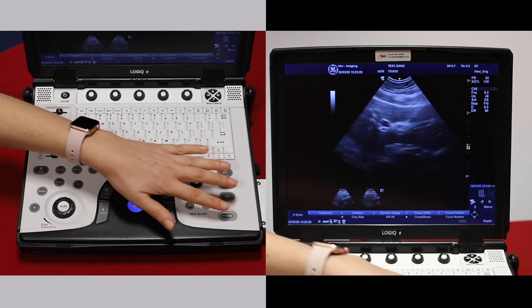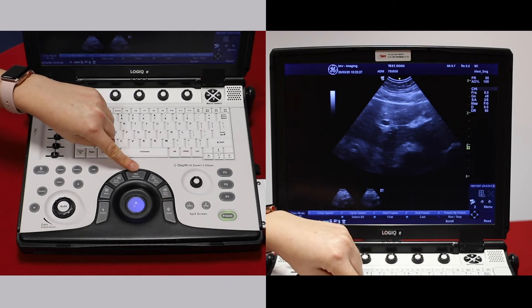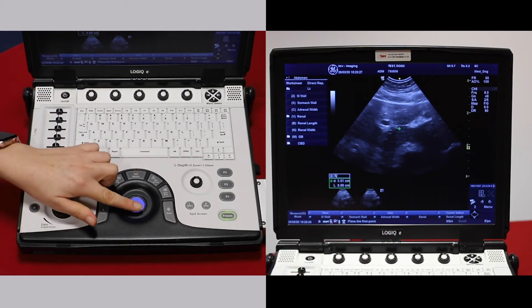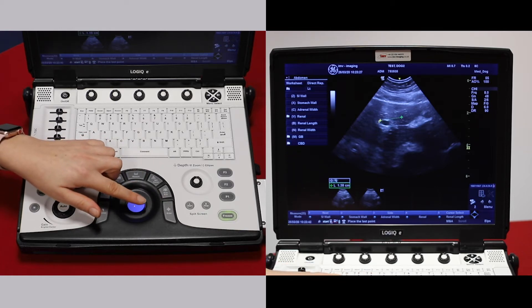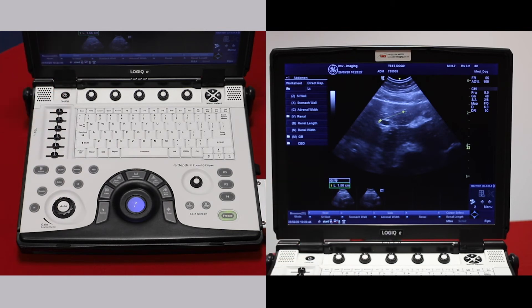To make a measurement, freeze your image. The measure function is just at the top of the trackball. If you just want to take a distance, move your trackball and press enter to place the first caliper, and enter again to place the second. The length is then displayed on the screen.